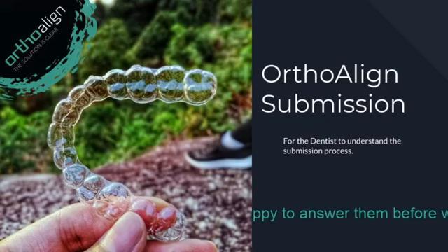It is also important that when you take your OPG, you export it as a JPEG. If you print out the x-ray, we don't recommend that you just take a cell phone picture of it. It's always better to export it as a JPEG and send that over to us. And of course, we would definitely prefer it to be sent through email. So that is for the x-ray data.